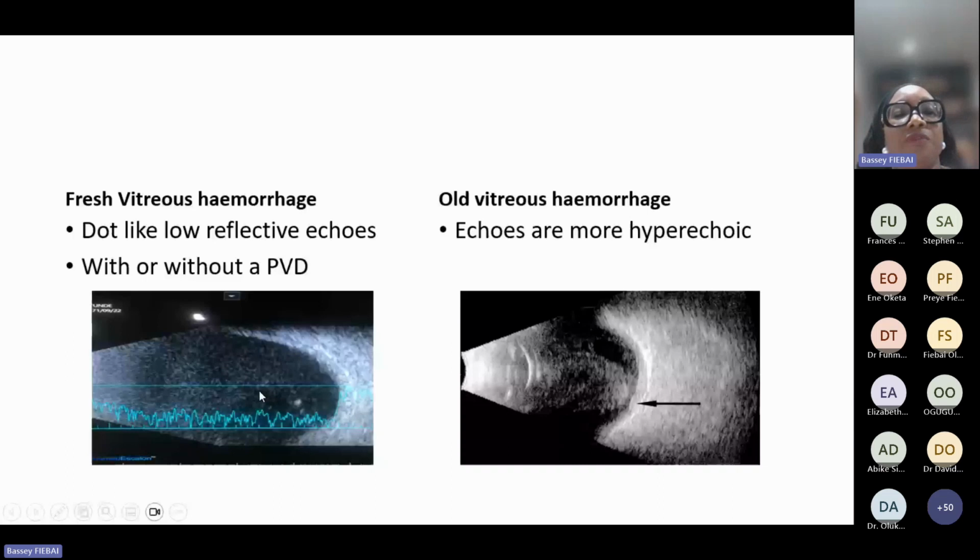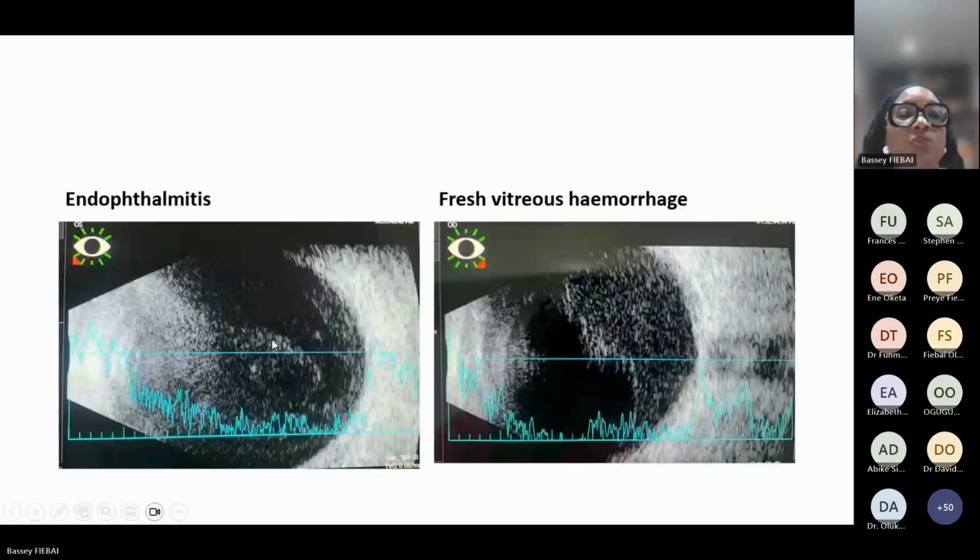Now, sometimes it can be very confusing when you want to differentiate between an endophthalmitis and a vitreous hemorrhage, and that's why clinical information is very important. So these are two different patients, but you could easily confuse this with a vitreous hemorrhage. But this patient had intravitreal Eylea and ended up with endophthalmitis, strictly patient-related issues. It had nothing to do with the injection. So we were able to use B-scan to follow up. We started her on very aggressive intravitreal antibiotics and peribulbar steroids, and she did very well.